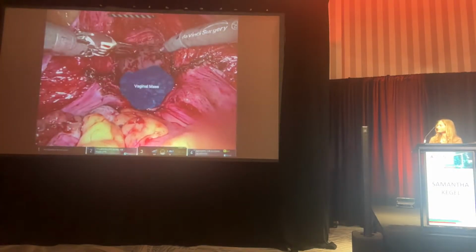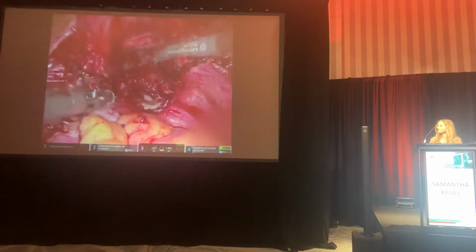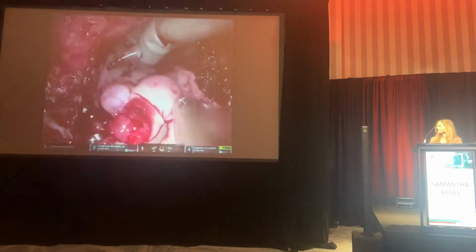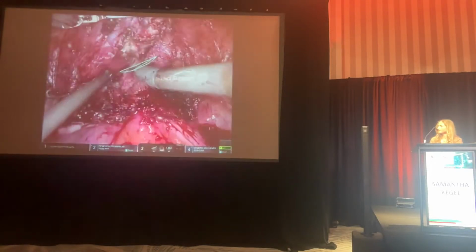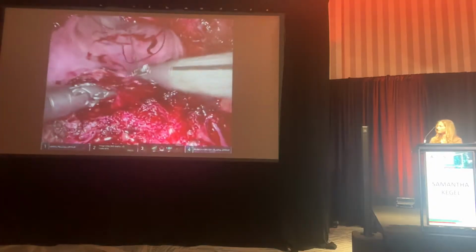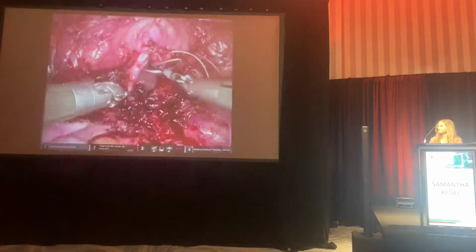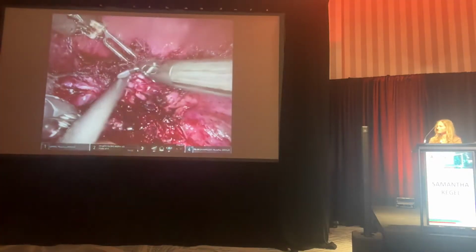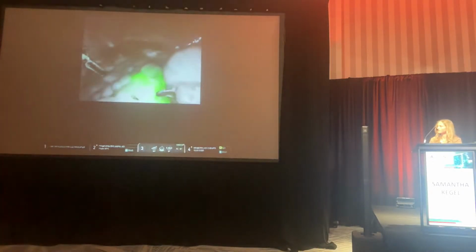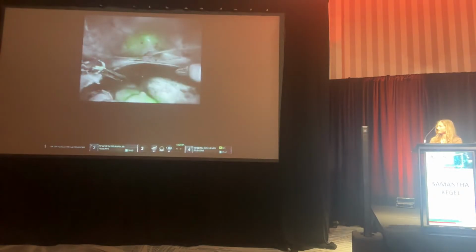Next, enterolysis was performed to carefully dissect the rectum away from the posterior vaginal wall and the uterosacral ligaments. A partial vaginectomy was then performed to excise the entire endometriosis implant. The posterior vaginal repair was performed in 2 layers in an interrupted fashion. The vaginal cuff was then closed in a vertical manner to preserve vaginal length. Cystoscopy confirmed bilateral ureteral function. Flexible sigmoidoscopy was then performed with an air leak test to ensure that the rectum was not compromised.